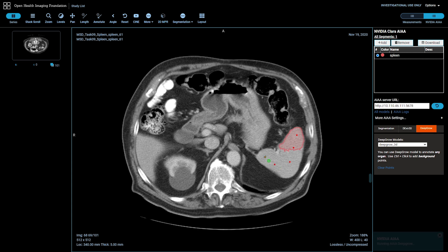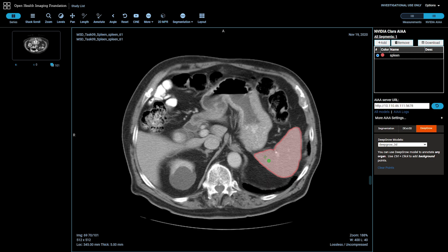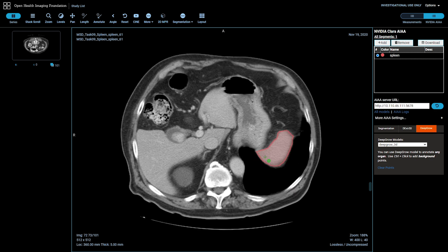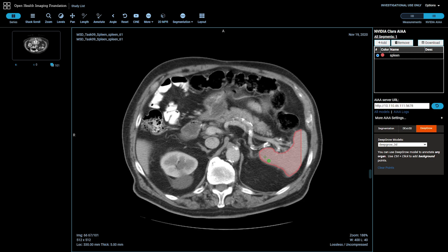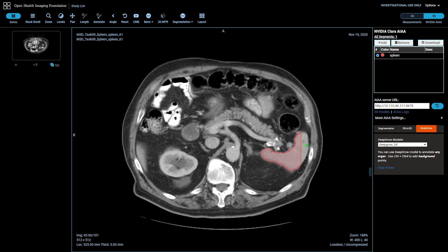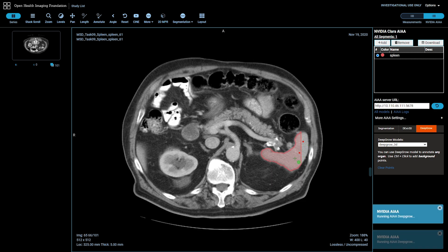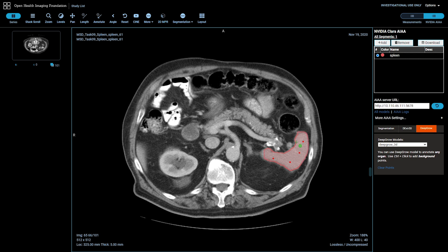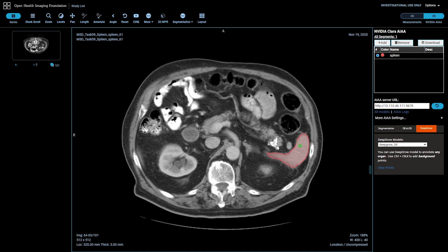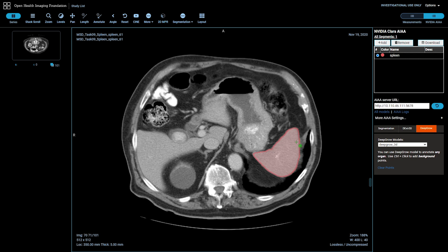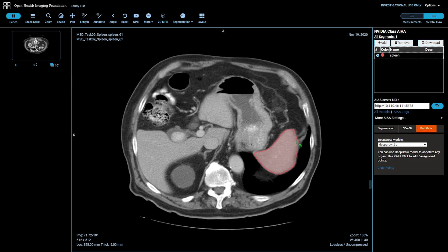Third, an upgraded version of our Deep Grow model that now gives you the ability to segment an organ in 3D with just a few clicks across the volume. If you're looking to enhance its accuracy, we've also included a training pipeline to help you fine-tune your own organ-specific Deep Grow 3D model.